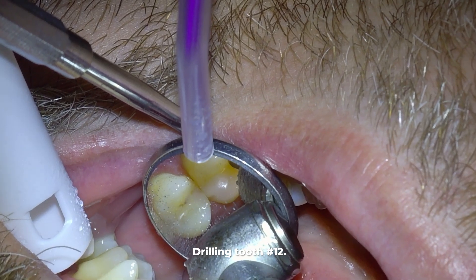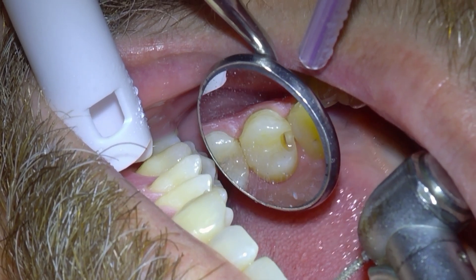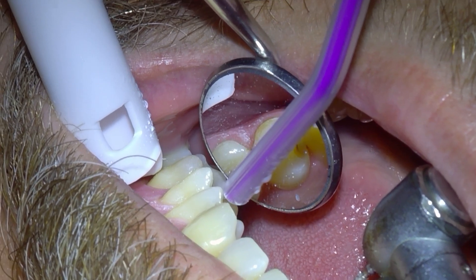It takes years to become fully used to drilling while looking in a mirror. Now I stop the drilling here so we can visualize the hole that we've made, because here we have barely uncovered the tooth decay.